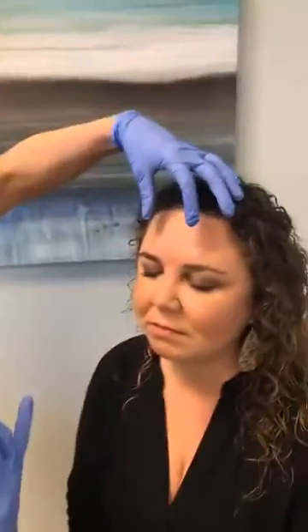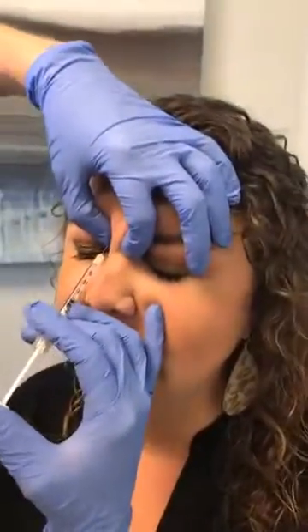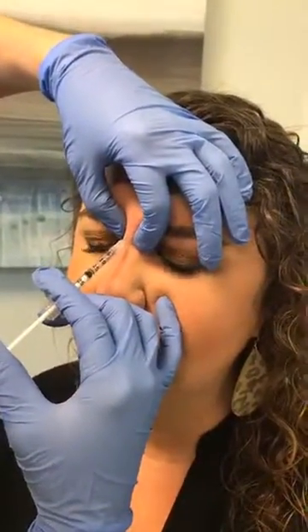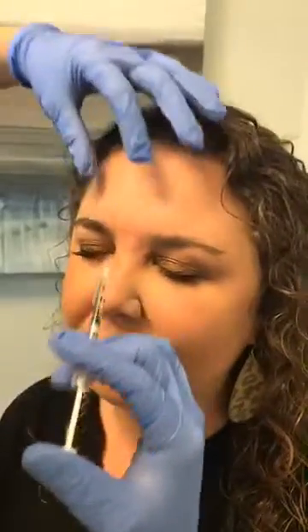So I'm gonna. Did you hear that? It does not hurt. We'll see. Make sure it's important that you show that it doesn't hurt. Yes. Okay. Give me a frown. All right. So I'm gonna go right here. Okay. Relax for me. Here's a stick. That was painless. Okay. Give me another frown.